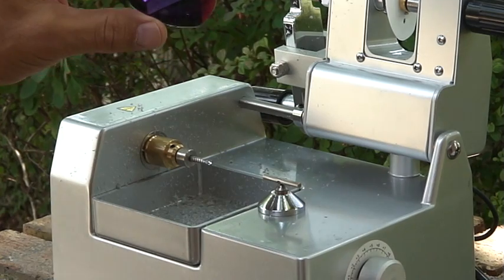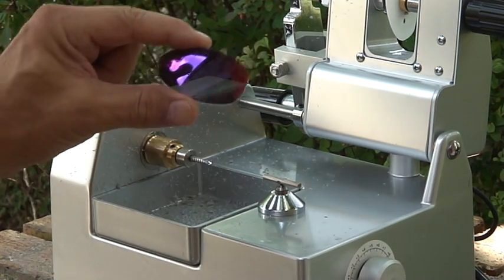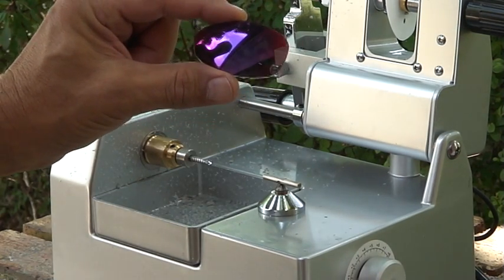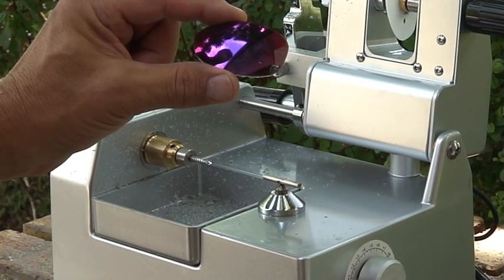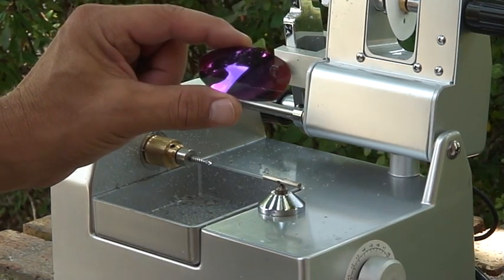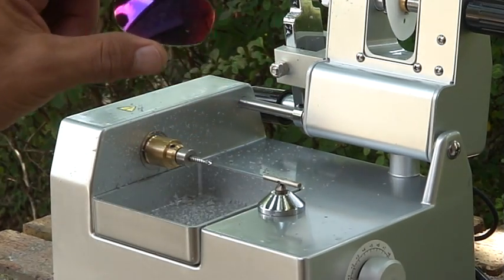And that's what we wound up with. I'll do a size comparison in a few, but that's where we've gotten to, and that's really it in a nutshell. Cutting lenses with a pattern maker and a lens cutter.